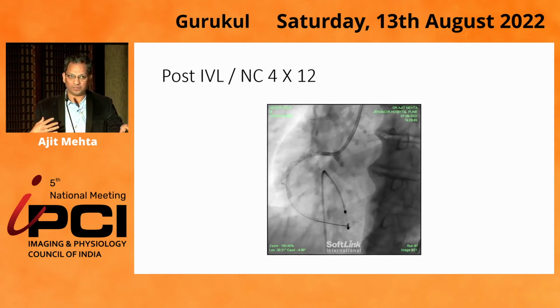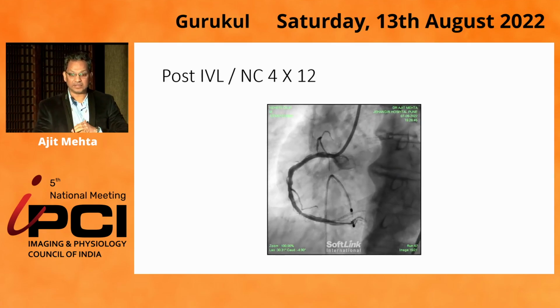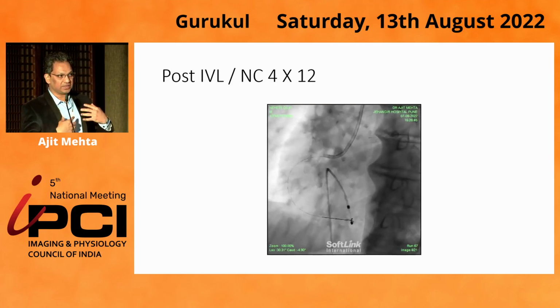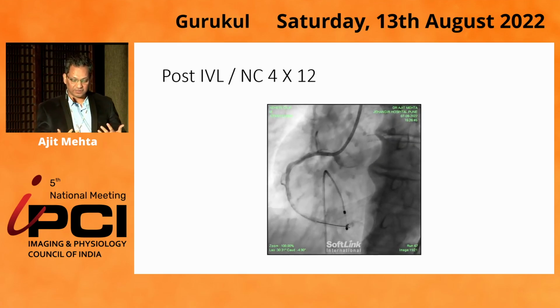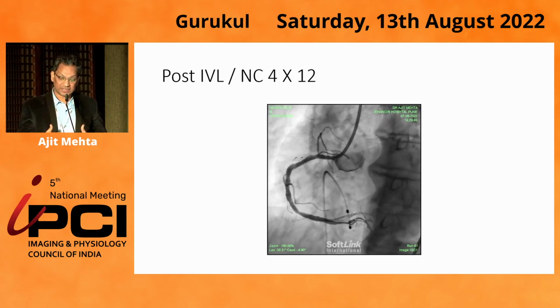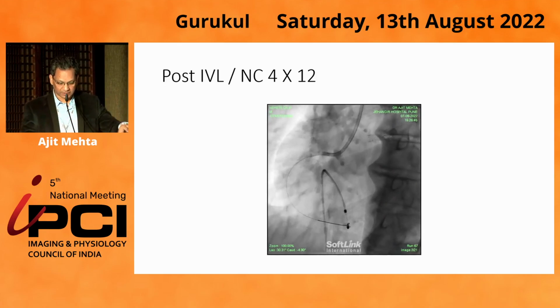Again, we didn't want to underestimate calcium. As we have seen in the earlier case, we have done IVL, we say we have done enough, we probably go ahead and put in a stent. But sometimes, in another view, the stent has not opened up. So we didn't want to take a chance. We did pre-dilatation again with a 4.0 by 12 balloon. We made sure that the balloon had uniformly expanded.